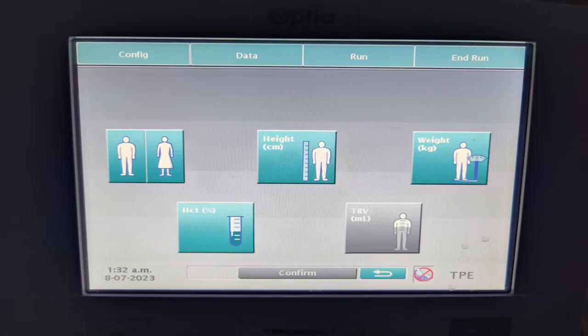Like any plasma exchange, we begin with entering the patient data. In this case, we will be entering whether the patient is male or female, height, weight, and hematocrit to calculate total blood volume.